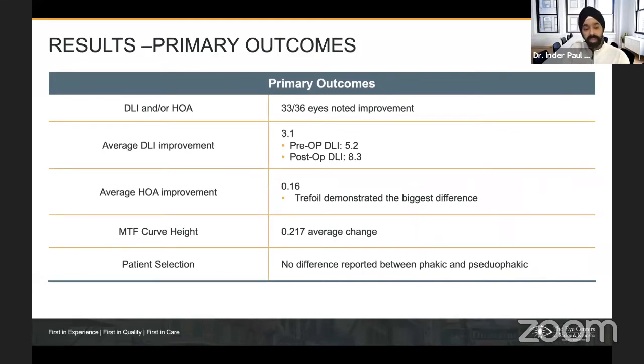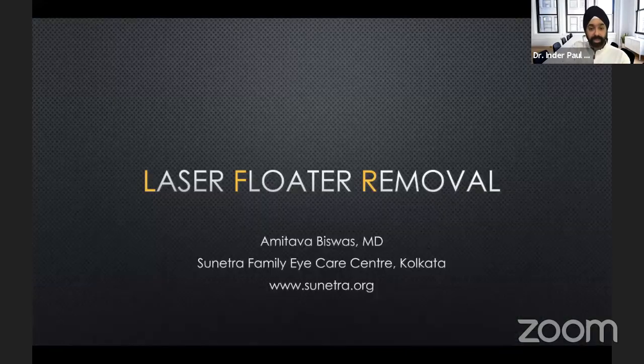In the results of the eye trace data that we presented, we did find an improvement in MTF curve and an improvement in higher order aberrations pre and post. And looking at HOA, trefoil demonstrated the biggest improvement in these patients with these large amorphous clouds.